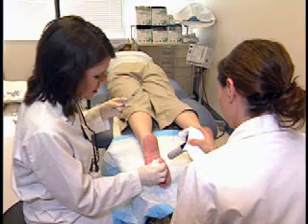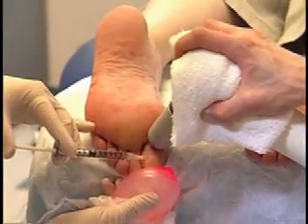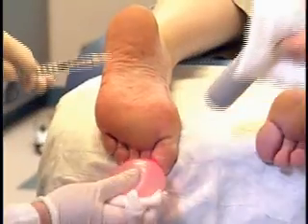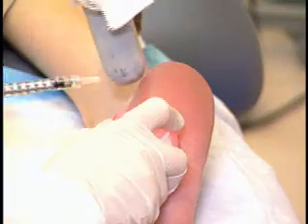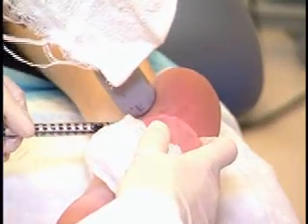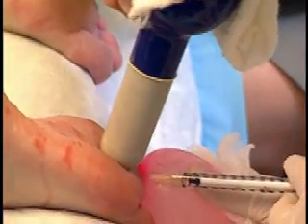The same process is used on the toes: apply ice, pressure, and vibration, then inject. Each digit receives two to three injections. The edge of the foot should also be injected as it is also a source of perspiration. Repeat the procedure on both feet.